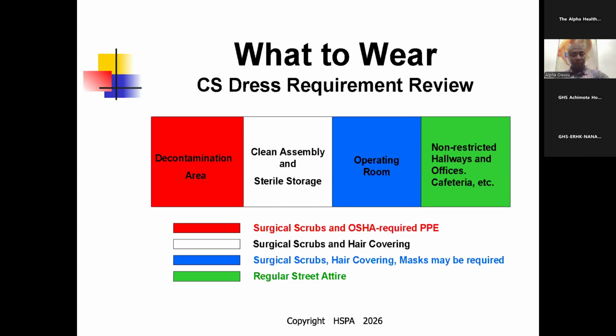In the decon, there you wear PPE. That is your hair cover, your nose, your glasses, your goggles, your gloves, your gown, your shoe cover as prescribed. And so please, facilities, let's make ready. You are saving your staff and saving patients.